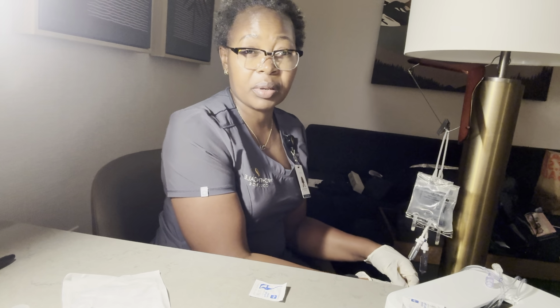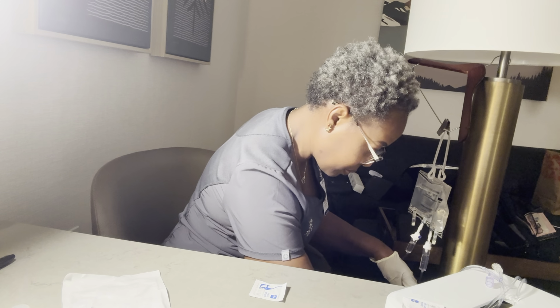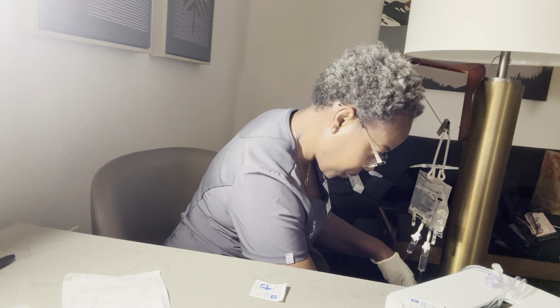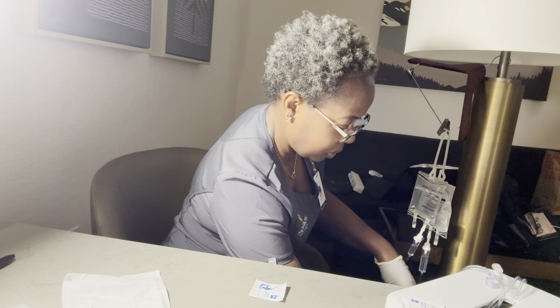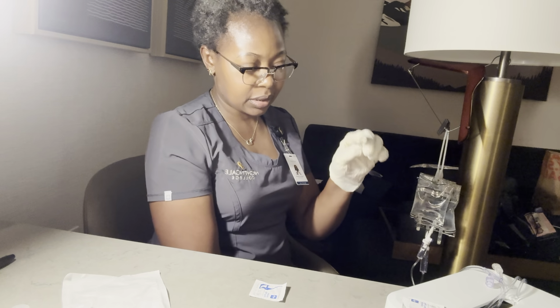And then I'll go ahead and open the clamp and prime the tubing. I'll close it.